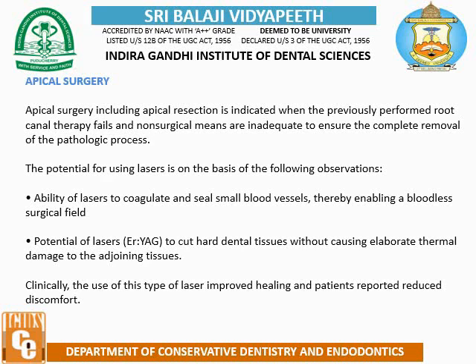The potential for using laser is based on the following observations: ability of laser to coagulate and seal small blood vessels, thereby enabling a bloodless surgical field; and potential of Er:YAG laser to cut hard dental tissues without causing elaborate thermal damage to the adjoining tissues. Clinically, the use of this type of laser improved healing and patients reported reduced discomfort.